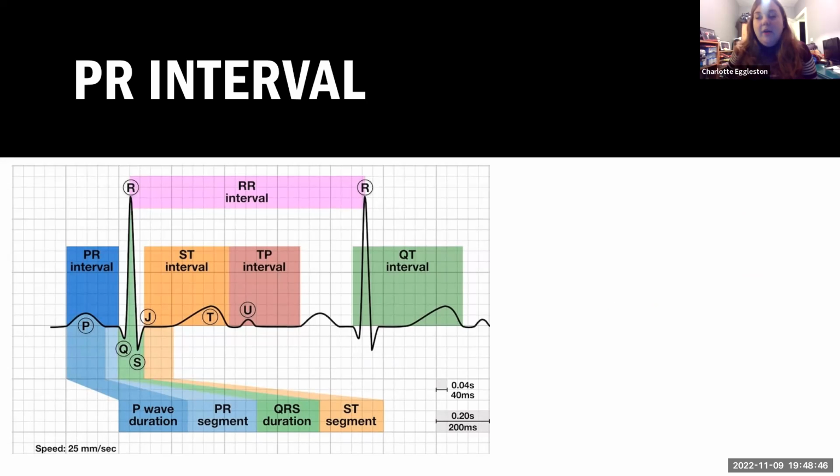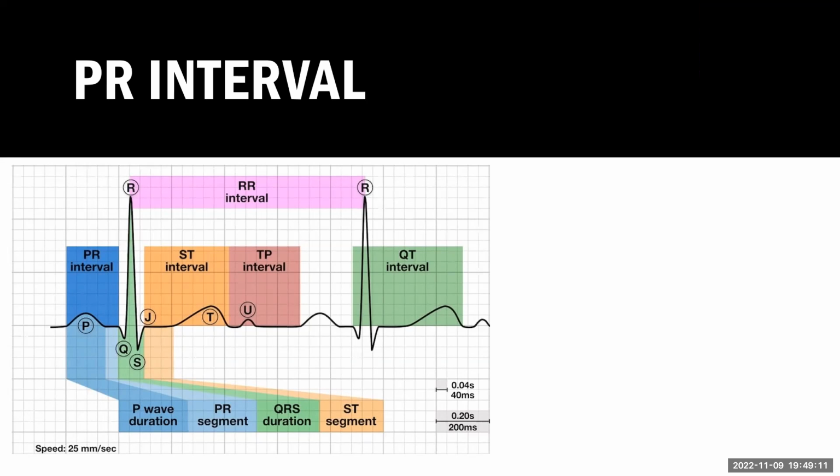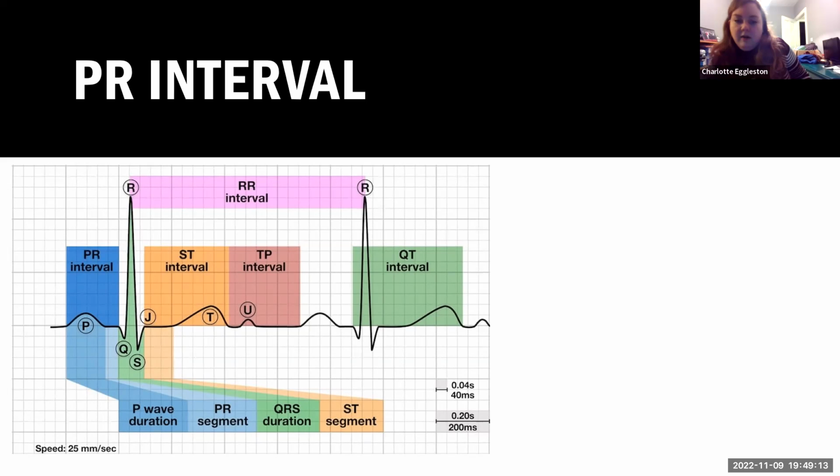It just tends to be that most people's axis points in that direction. So it tends to be that that's your clearest QRS because it's the most positive. So it helps to identify any pathology. It tends to be one with quite a nice tracing. You'll notice sometimes you get tiny Q waves if you haven't got that much electricity in that direction. So it tends to give you a nice tracing. Okay, good, thank you.